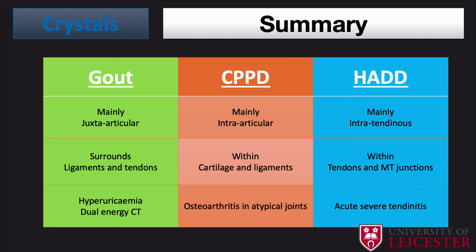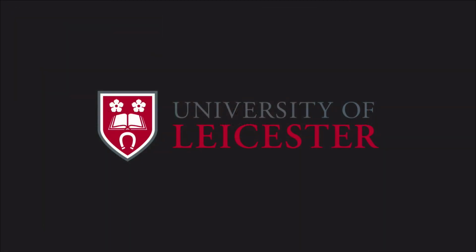They obviously do have specific hallmark radiological features, which we've discussed throughout this lecture. But think about the other things, such as whether we could image with specific CTs, and think about barbotage, especially in patients that have hydroxyapatite deposition disease, because an acute tendinitis is extremely painful, and it is something that can be resolved. So I think in summary, we've covered quite a lot.